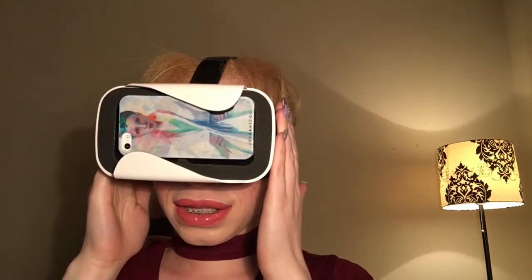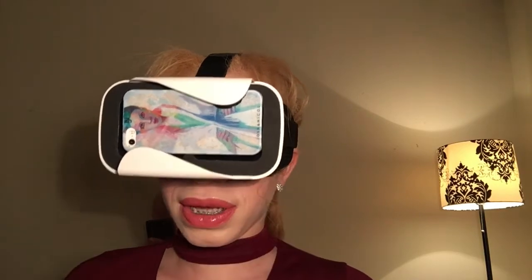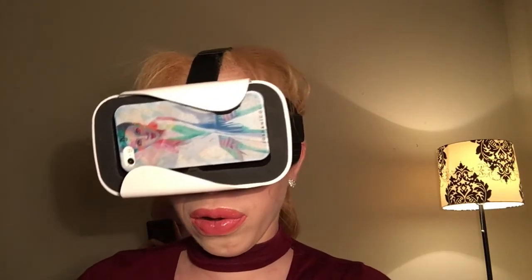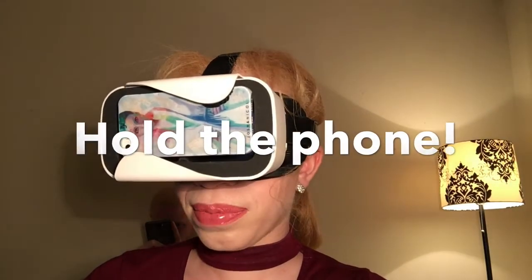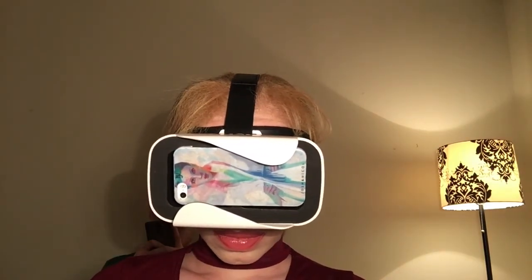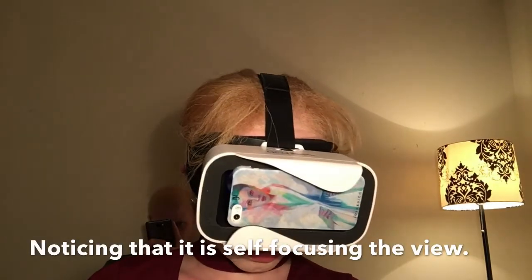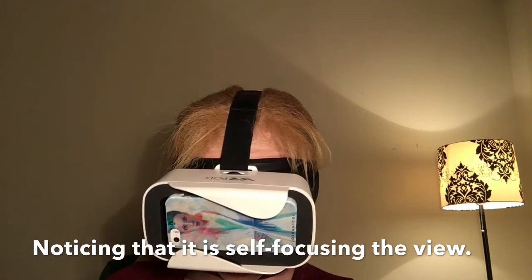I give this headset a five-star thumbs up because it's basic and does just what I needed it to do, which is hold my phone so I can use the magnifier app. And yes, the Supervision app is self-adjusting, which is really awesome — when I look at something it adjusts the distance for me.